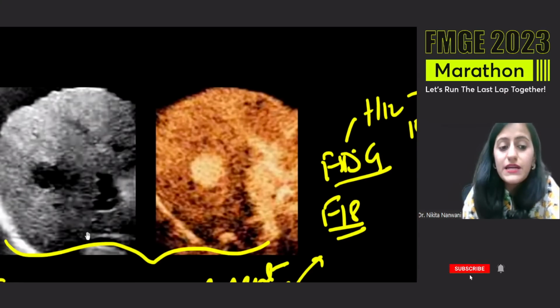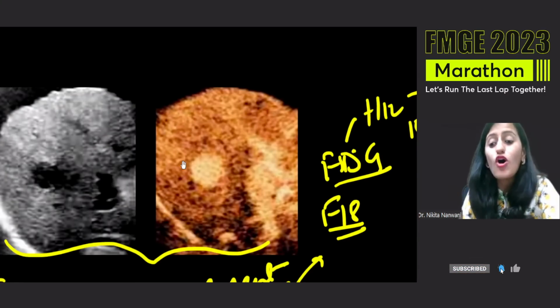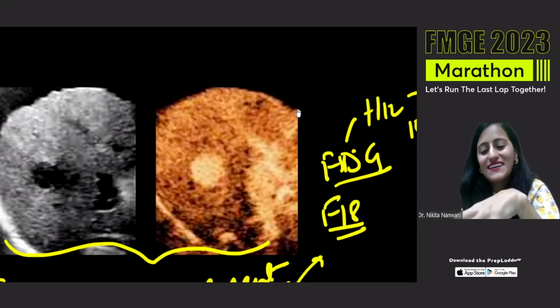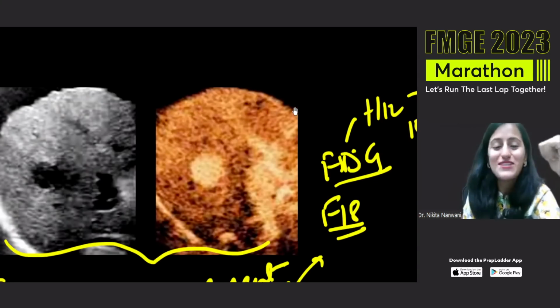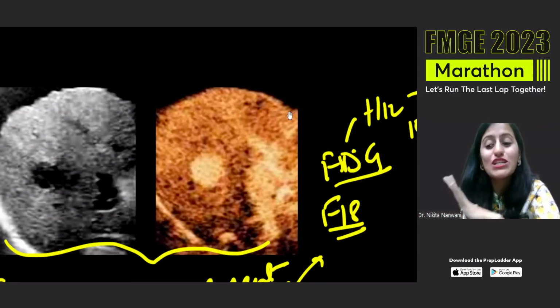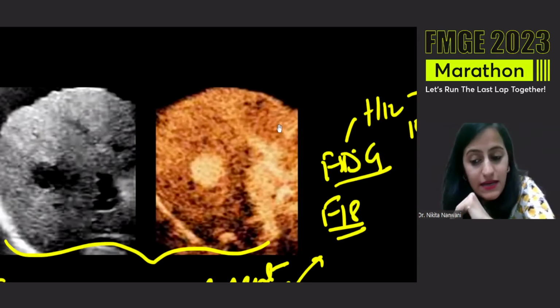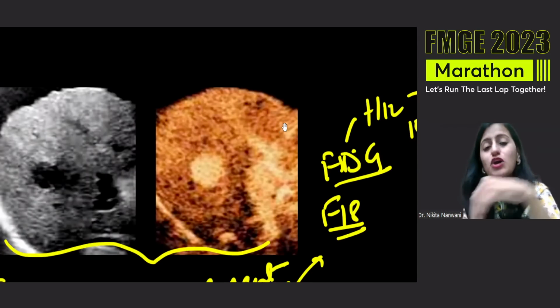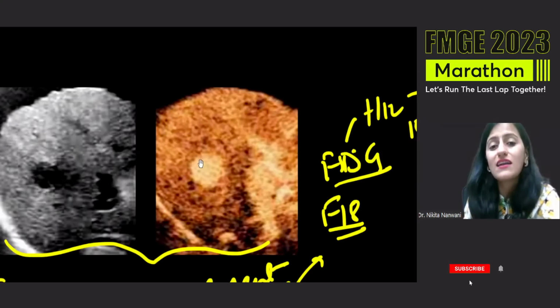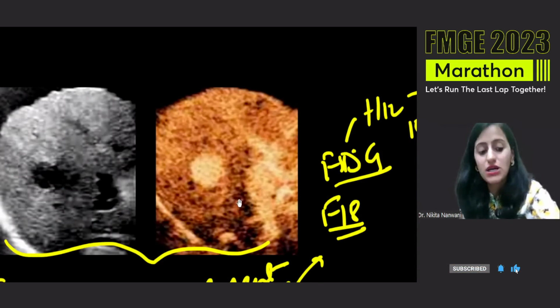This one is a routine ultrasound. But what is this when you see the orange colored ultrasound? There's no investigation like colored ultrasound. See, orange CT is a PET CT. Orange ultrasound is not a PET ultrasound. This is not a Doppler. Right, Nazish, this is not a Doppler because Doppler is for blood vessels. You are not just seeing the blood vessels colorful here. It's the entire black and white image which has become orange color here.